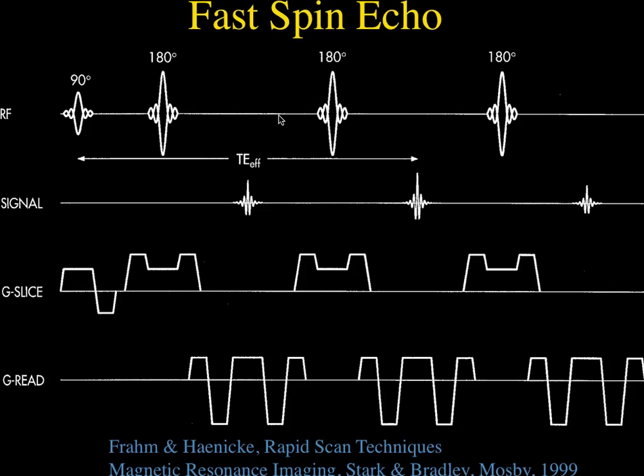So there are a lot of things to play with in fast spin echo imaging, and that's why it took a number of years before we came up with the modern sequences, where we get speed and diagnostic accuracy at the same time.